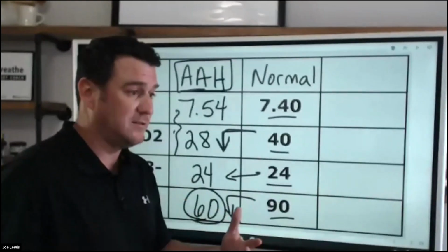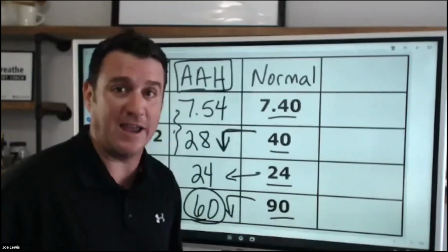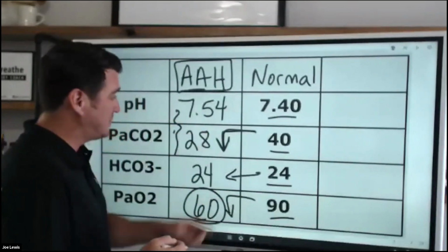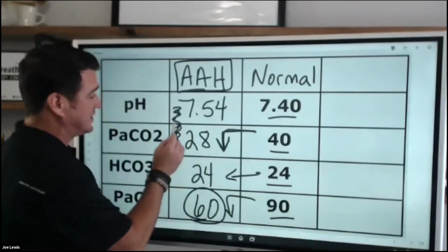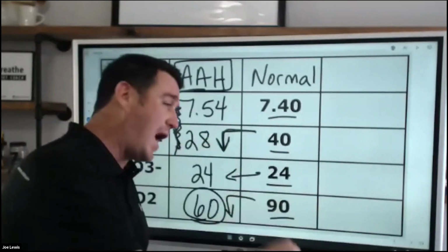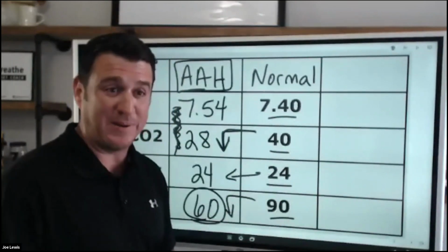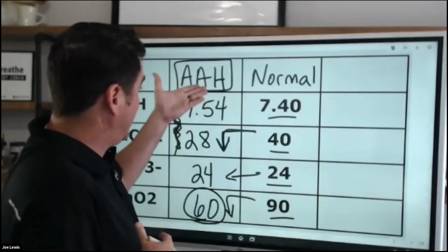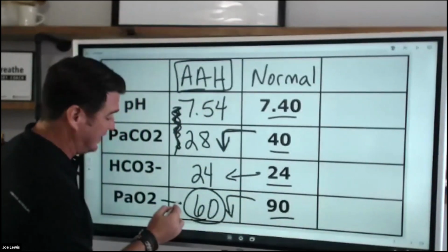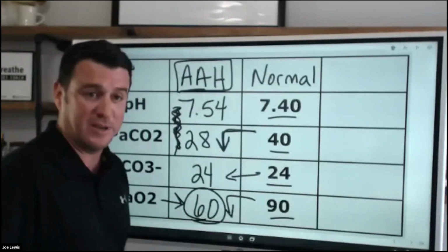Now, again, how are we going to fix it, right? If you had this patient, what would you consider fixing? We get sometimes caught up in going, oh, we got to fix this. But if we will always go back and ask ourselves, why is the hyperventilation happening? Because now we understand that that's what it is. Then we recognize that this person has been hyperventilating because of hypoxemia.